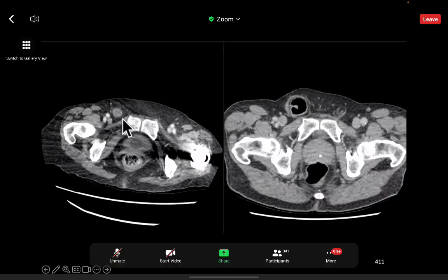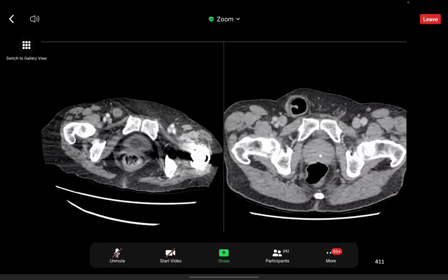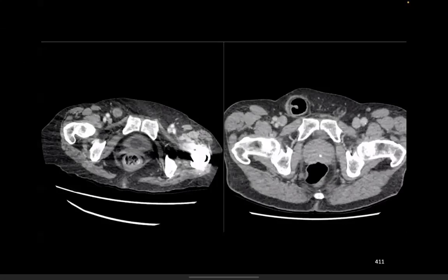Now, because the femoral hernia, the peritoneum, the omentum, plus or minus bowel, is going into the femoral canal. The femoral canal is a small anatomical area that's normally got the vein, artery, and nerve in. So if you've got a small canal and you put something else into it, which of those 3 structures that go through the canal is likely to be squashed? Yeah, it's the vein, isn't it? So you've got the femoral vein, which is going to be squashed. And I'm going to demonstrate that on the next couple of slides.